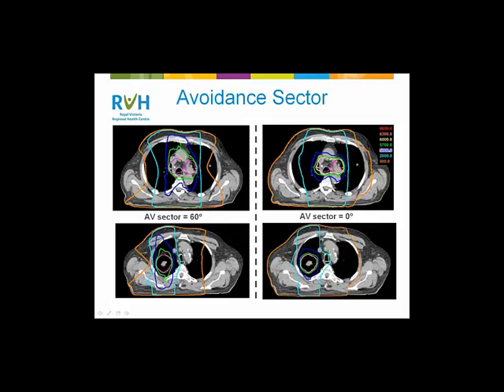However, it also results in the largest field sizes that are required in the X direction, which can limit how far the MLC can travel. So it's sort of bad from that perspective. What we ended up using was, I did plans for several patients with 15, 30, and 45. When I looked at the monitor units, they tended to be lower with 45 degrees. And when I played the movie, the fields were open more with 45 degrees.